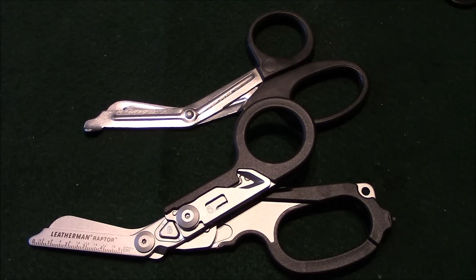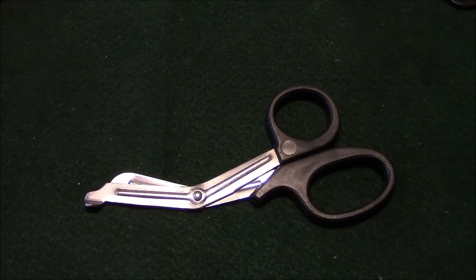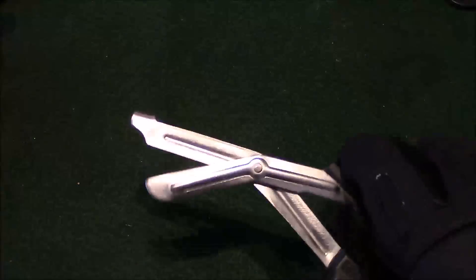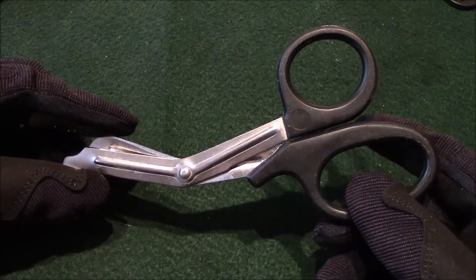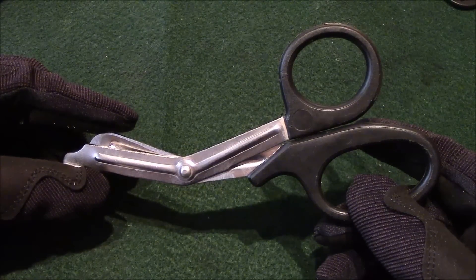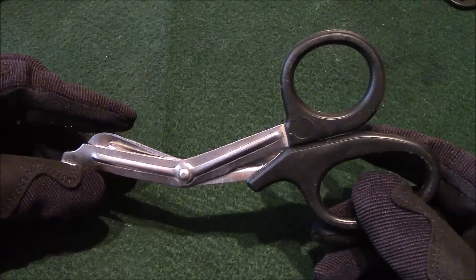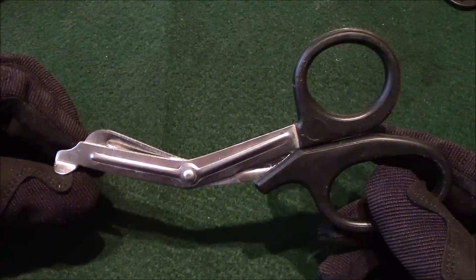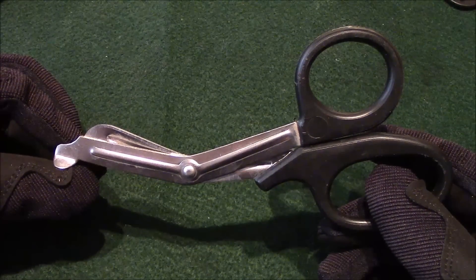Let's go through all the functions and tools on this awesome piece of equipment. The first thing I wanted to show you was just the regular EMT shears, or what some people refer to as trauma shears. Really, the only thing you can do with these is cut through clothing. It's fairly inexpensive — you can pick up one for a few bucks at a dollar store, Harbor Freight, or through your medical supply company.